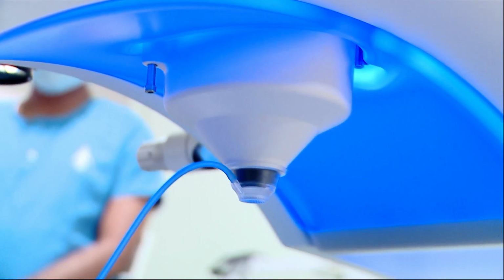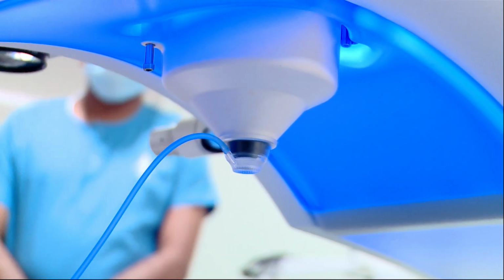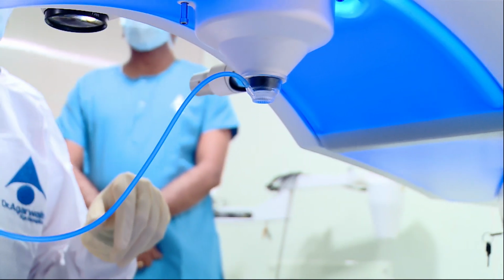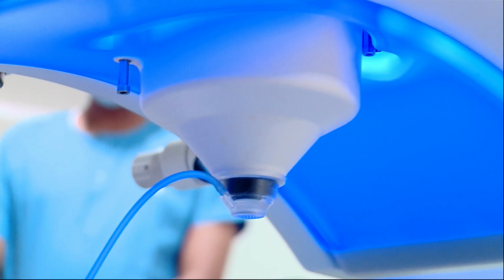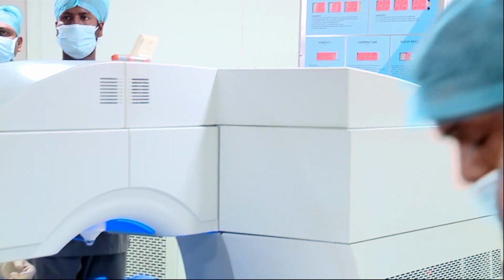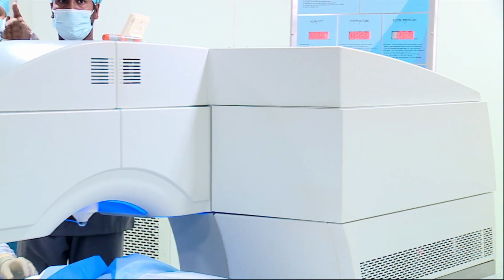Okay. So we are just putting in the speculum. Give me this thing. I'll just wet the cornea a little bit. Are you getting the microscope view or the external camera now? Okay, anyway, you give the microscope view, I think. So anyway, the eye we are taking below the patient interface.